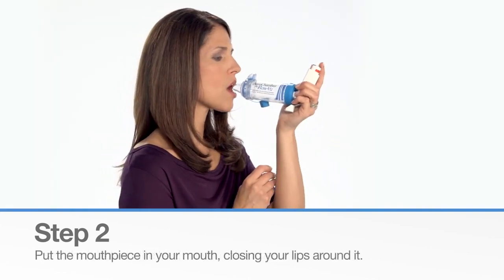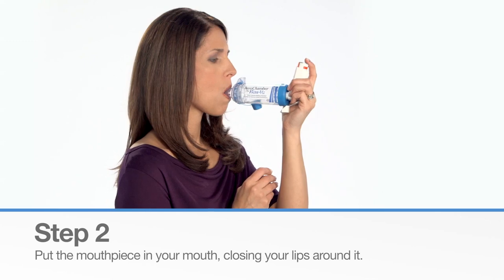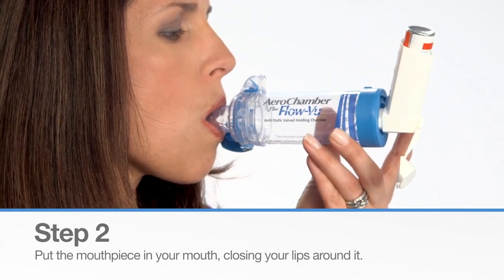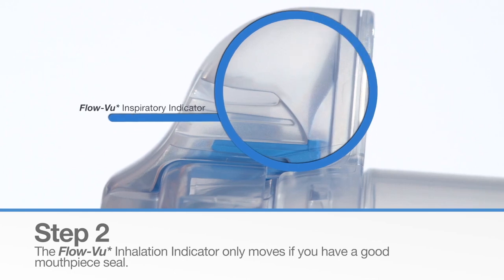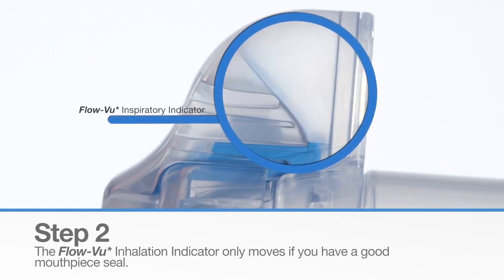Put the chamber mouthpiece in your mouth, closing your lips around it, forming a good seal. The FlowView Inspiratory Indicator only moves if you have a good mouthpiece seal.